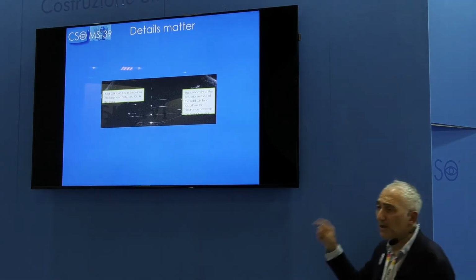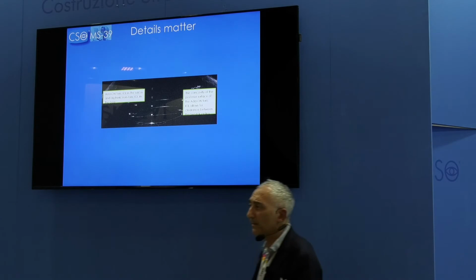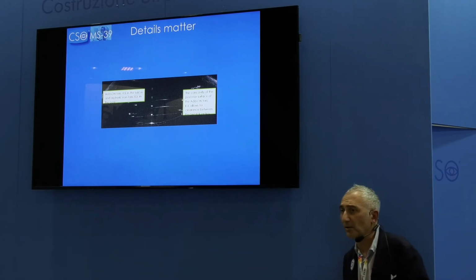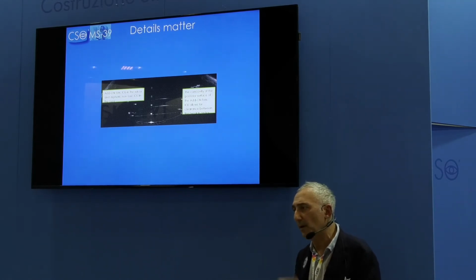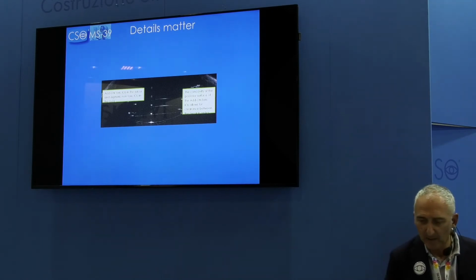And as the patient had cataract and residual regular astigmatism, we went for cataract extraction and add-on toric IOL implantation, so that in case in the future we have to do something to that cornea, we can always take away the add-on IOL and go on with other surgeries.